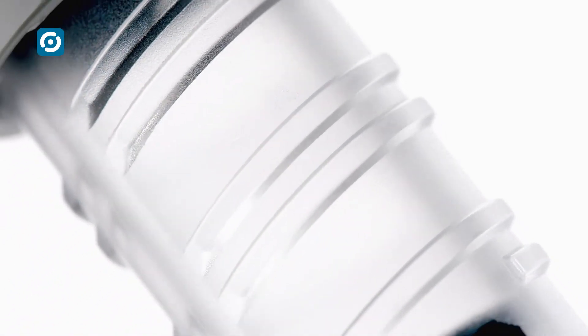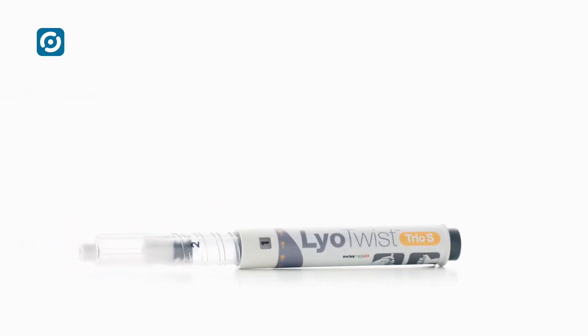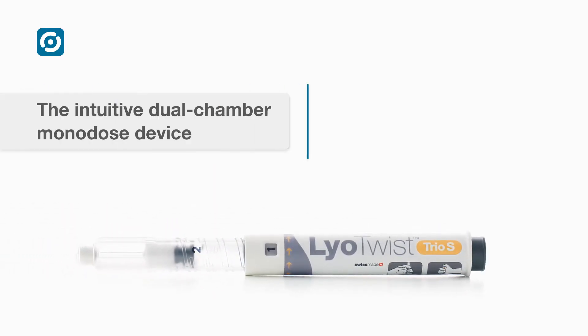Easy to use. Dual-chamber, single-dose injector. Proven technology. That's a LyoTwist.